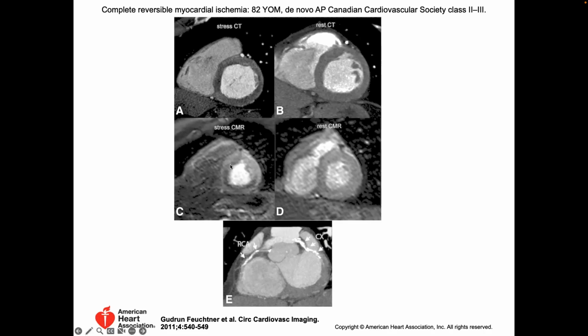Remember, in nuclear medicine, this donut would be really blurry, but you would hope that you would see a darker signal down here. And to be honest, for this patient, you don't really need high resolution here. We just need to detect that it's down on half the heart, right? So resolution isn't a key element for that patient, right?